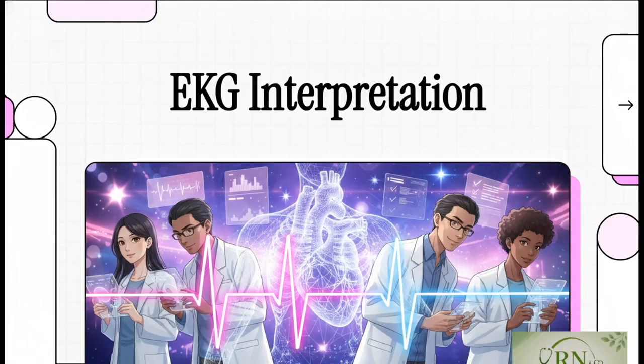So be honest, do you remember the very first time you looked at an EKG strip as a nursing student? It probably felt like you were trying to read some sort of ancient hieroglyphics, right? Well, you are absolutely not alone in that. It can be super intimidating. But today, we're going to transform that mystery into complete mastery. We're taking a really structured, energetic, purely clinical approach to breaking down these strips. By the end of this explainer, you're going to see exactly how a simple checklist turns a bunch of chaotic squiggly lines into a really confident diagnosis.